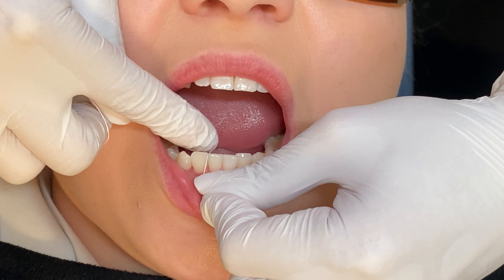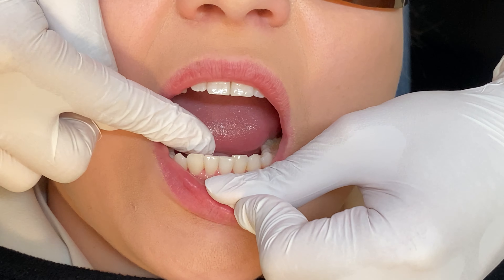Teeth can contact and touch below the gum line, so you need to make sure you are going beneath the gum line to check this.